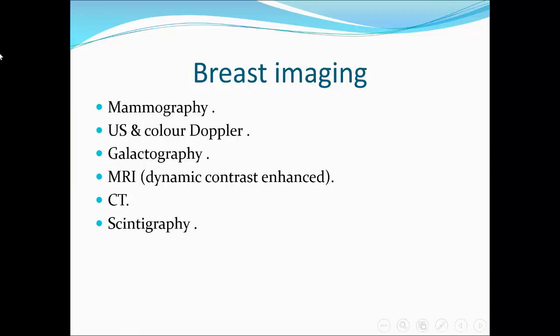Breast imaging will include mammography, ultrasound and color Doppler. Galactography is an underused procedure and not done nowadays. And then we have the MRI, the CT and scintigraphy. And we have also the advanced mammographic techniques on the digital mammography like contrast enhanced mammography and tomosynthesis.